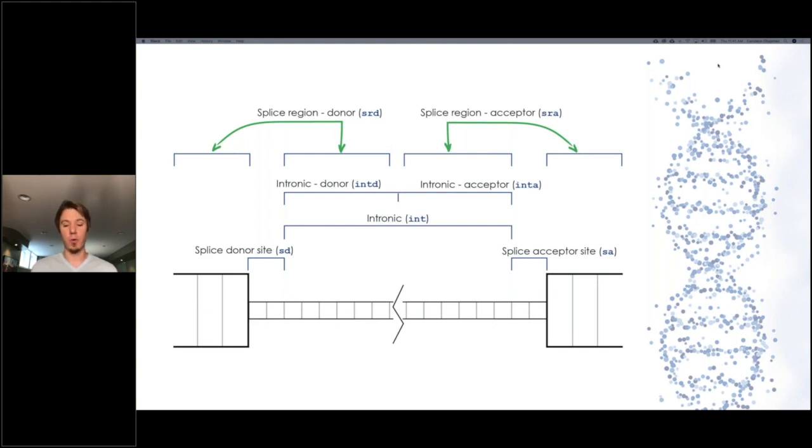When we show the results for that, we're using what you search to prioritize nucleotide or cDNA level matches within the papers at the top so that you can see those first, but at the same time showing you any other variant that might be highly relevant to what you are searching for, meaning a different cDNA change that has the same or a very similar biological effect. We want to include those as well.